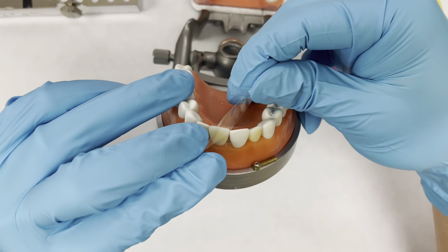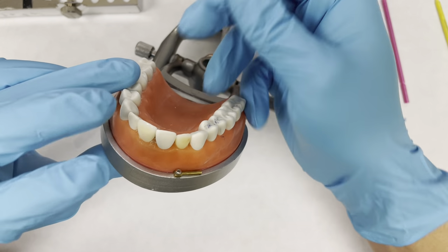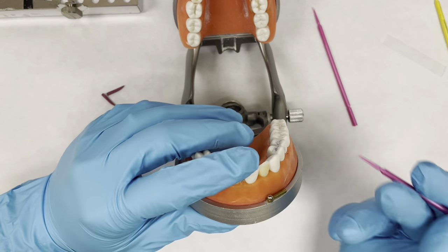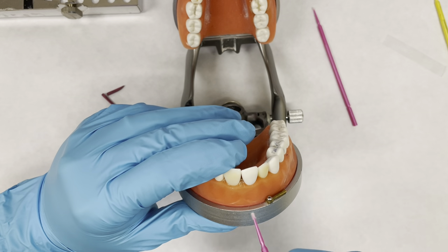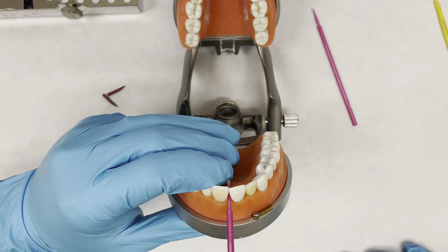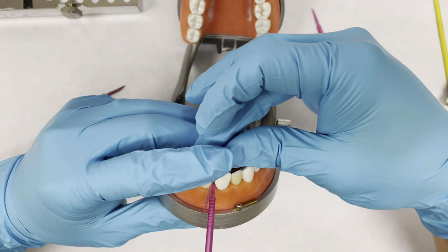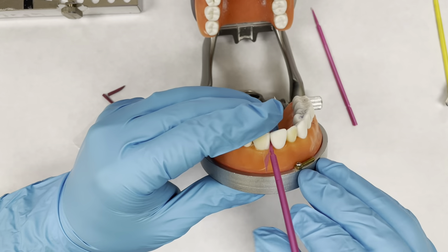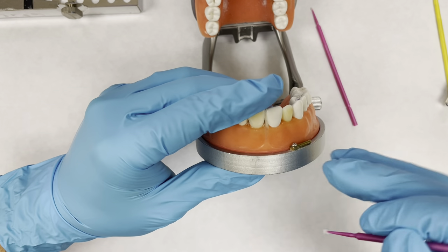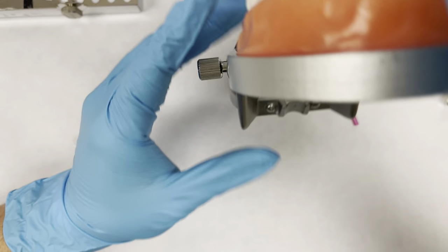If you look right here, the contact is too tight for the mylar strip. So you can just take a micro brush or you can take a wedge. A micro brush is easy because you can shove it in really fast, then take it out really fast. You just create a little bit of space, get that micro brush in there, then pull it out. And now it's nice and tight, locked.